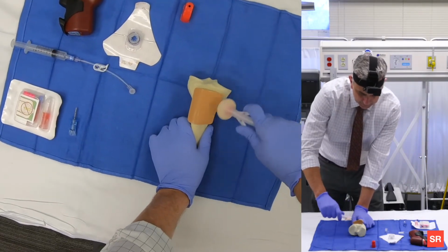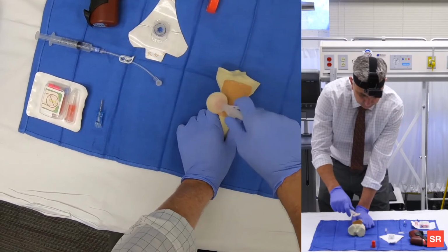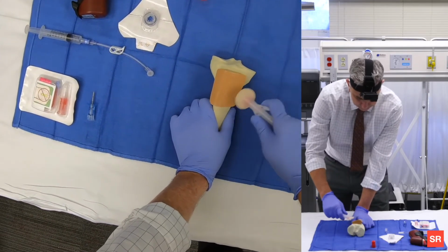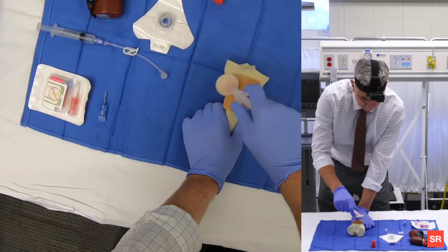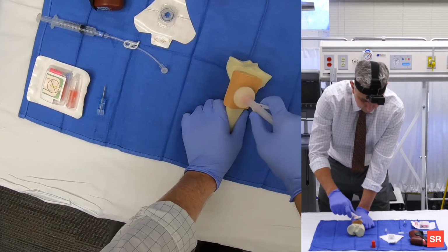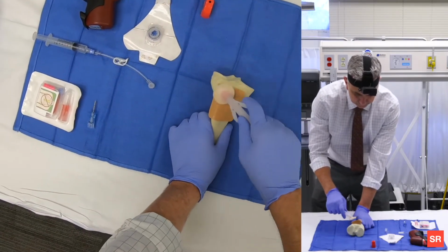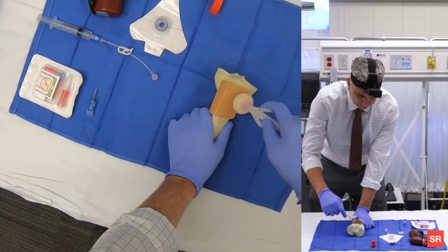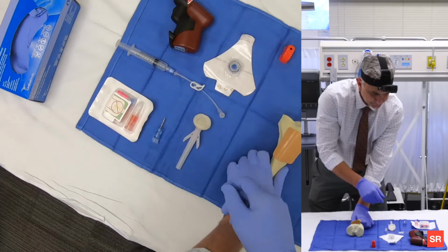So this is going to be 30 seconds of cleansing. Okay, so the area is now cleansed.